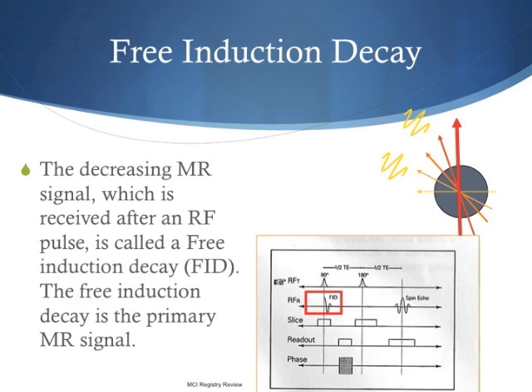And while this is happening, signal is coming from the proton itself. That is the basis of MR imaging. The only thing you do not see in this picture representation is the wobbling back to the longitudinal state, because this is a one-dimensional picture on a PowerPoint.